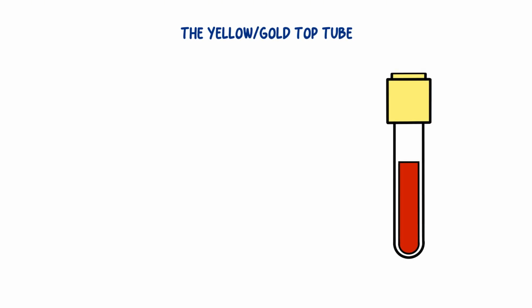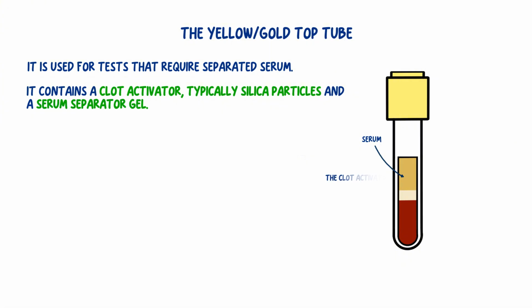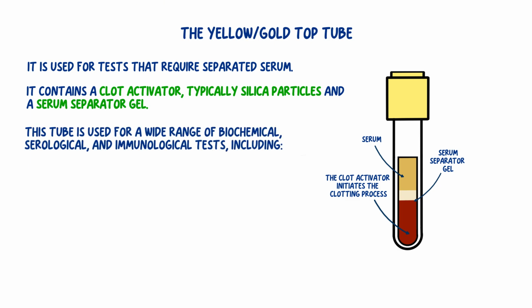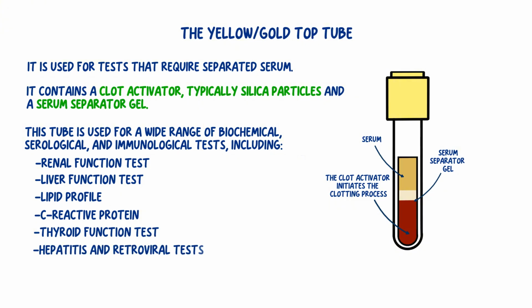The yellow or gold top tube is designed for tests that require separated serum. It contains a clot activator, typically silica particles, and a serum separator gel. The clot activator initiates the clotting process, while the serum gel forms a barrier during centrifugation, separating the blood cells from the serum. This tube is used for a wide range of biochemical, serological, and immunological tests, including renal function test, liver function test, lipid profile, C-reactive protein, thyroid function test, hepatitis, and retroviral tests.